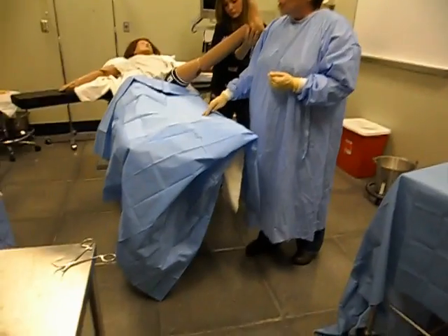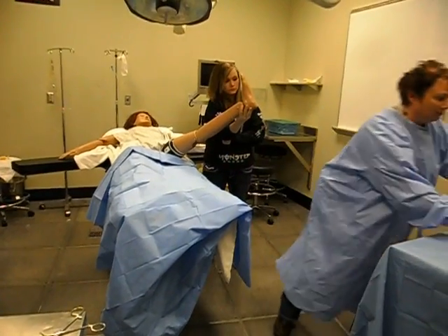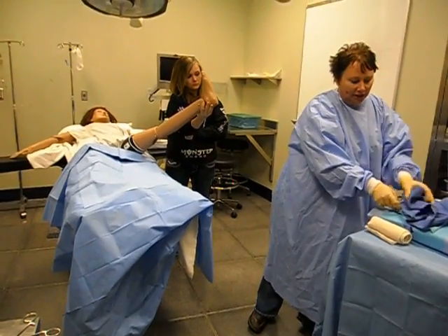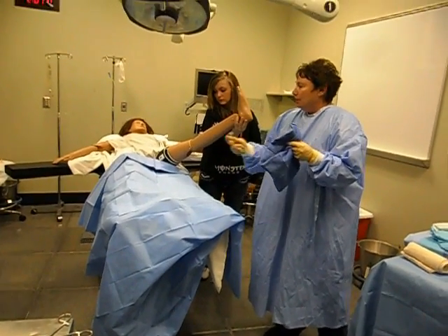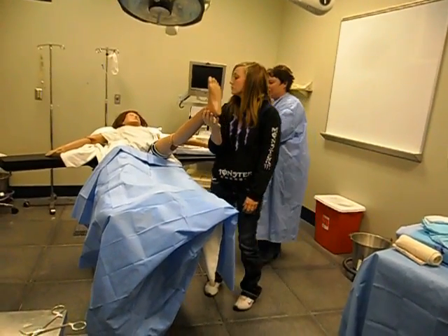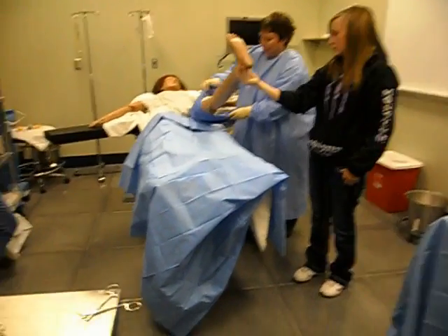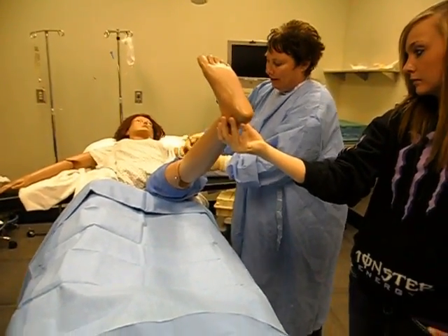You do not need to even put a sheet on here, but you're going to see why it is real handy — number one, you can use it as a table. I could bring all the rest of my drapes up and use this as a sterile table. Another thing it does is when you're putting the towel around the tourniquet, it adds protection. So I'm going to come around Randy here, reach around, come around with this towel, wrap it around the tourniquet — don't touch the tourniquet, it's not sterile — crisscross it, and then clip it.